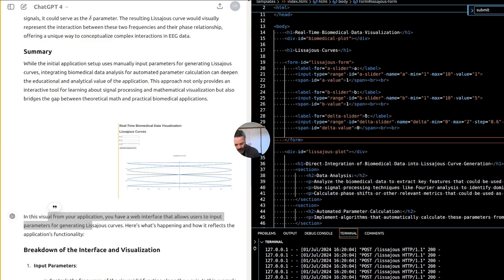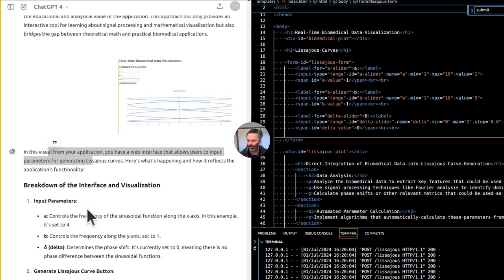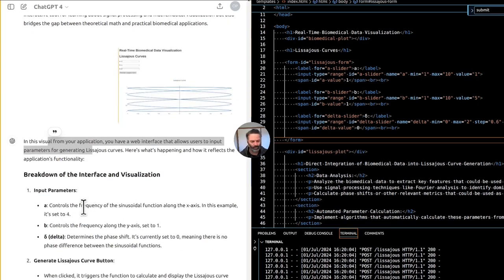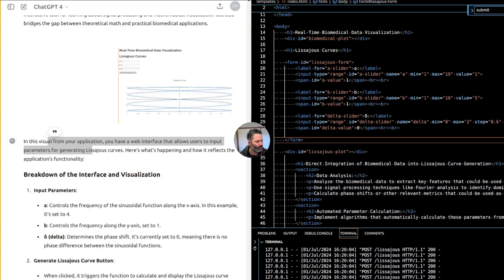Input parameters: A controls the frequency of the sinusoidal function along the x-axis. In this example, it's set to 4. B controls the frequency along the y-axis, set to 1. The delta determines the phase shift. It's currently set to 0, meaning there is no phase difference between the sinusoidal functions.